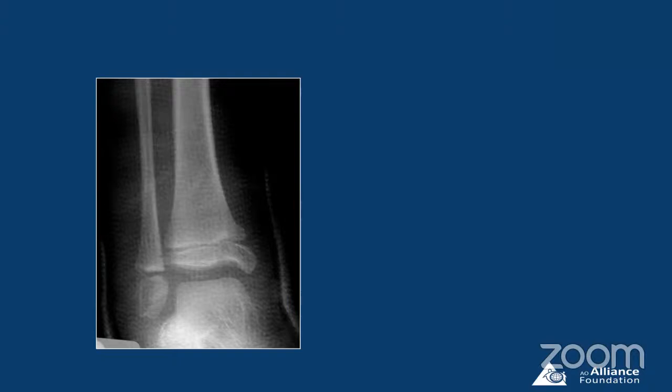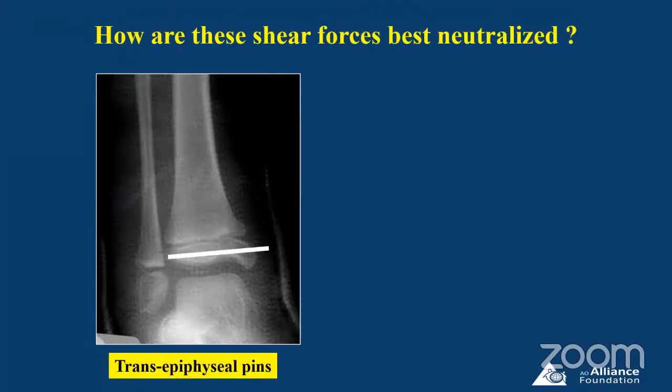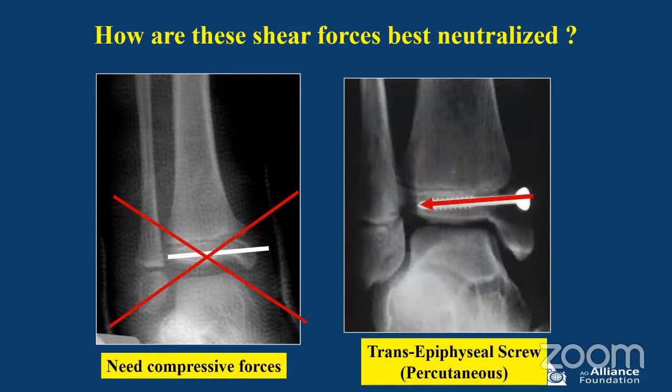Yeah, so after reduction, what you should do is see that the width is equal and there are vertical shear forces. So you need to reduce those by a transverse pin. And that pin, instead of a K-wire, needs to be a cannulated cancellous screw for compression. So a cannulated screw which is intra-epiphyseal, percutaneous. Again, this does not finish the treatment.